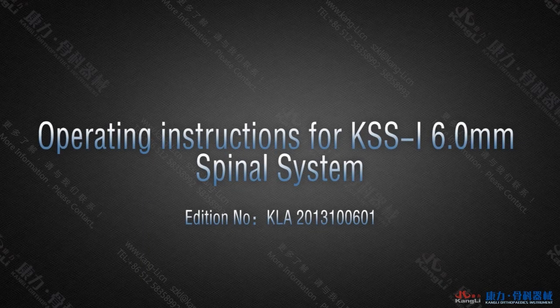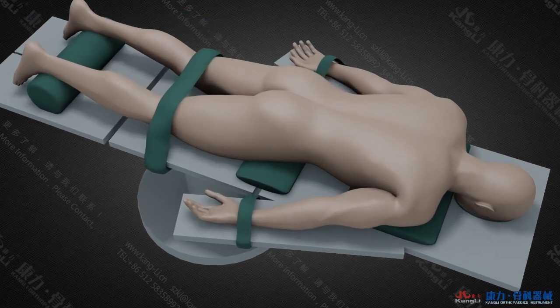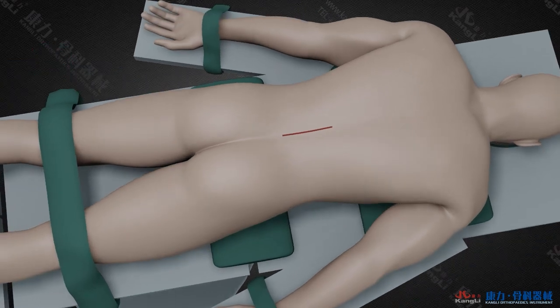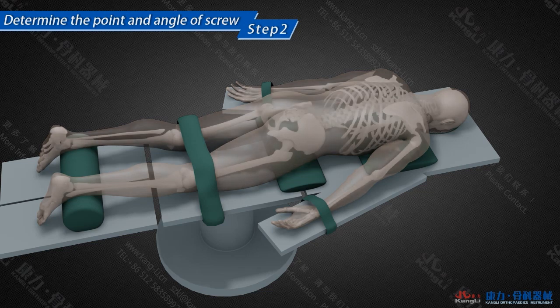Operating instructions for KSS-I 6.0mm spinal system. Step 1. The body position and incision. Let the patient lie on the bed. Take prone position. Fix the upper limb temporarily. Make an incision in the midline, along the line of the back, and determine the position and length of the incision according to the damaged segment.